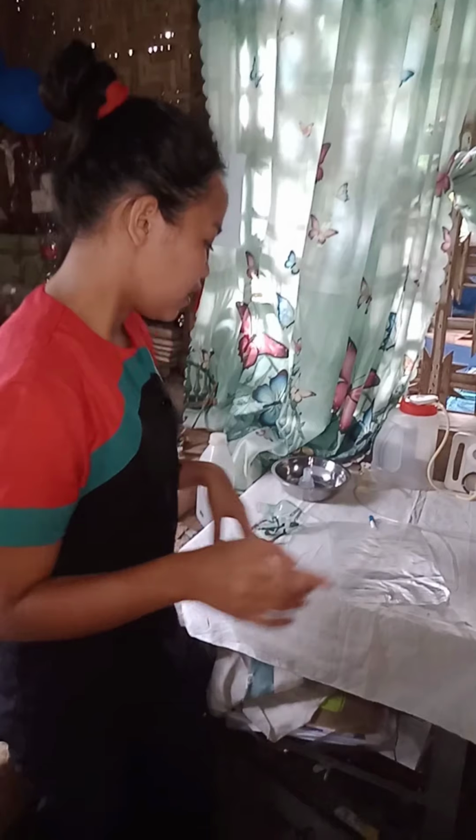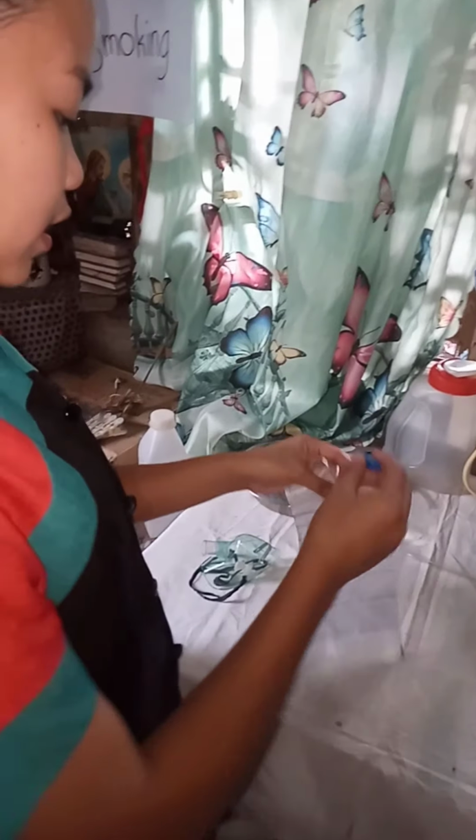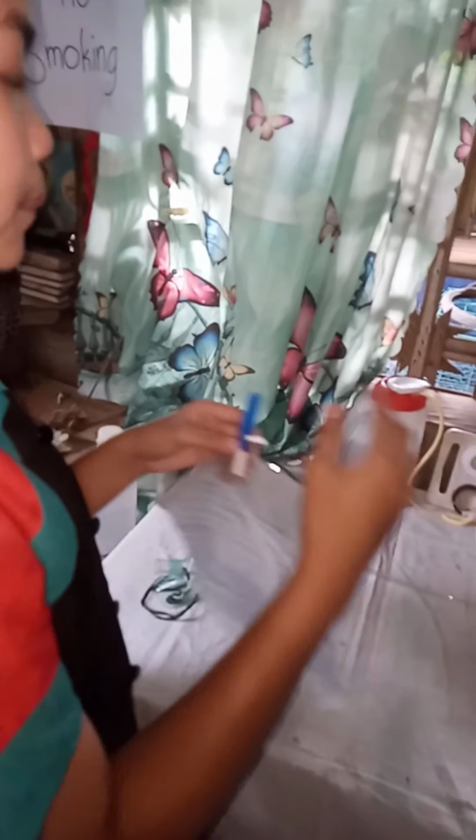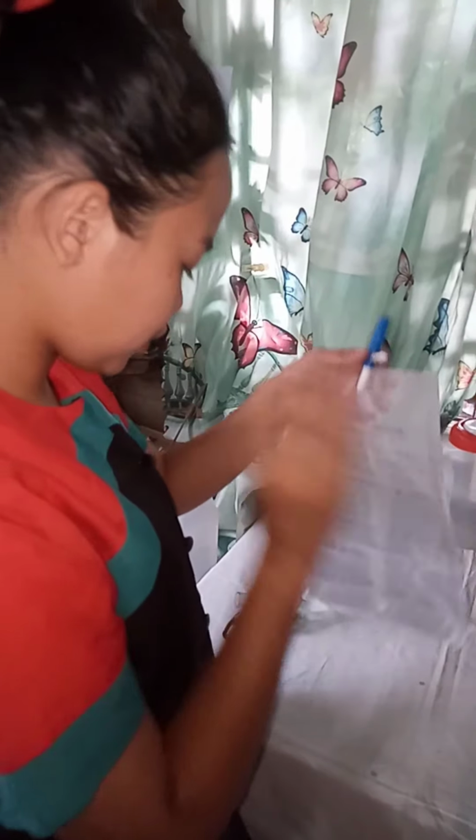The non-rebreather mask and the rebreather mask have just some differences. The only difference is we need to put this valve in here because it is a one-way valve. The person can suck oxygen out of the reservoir, but can never breathe back into the bag.